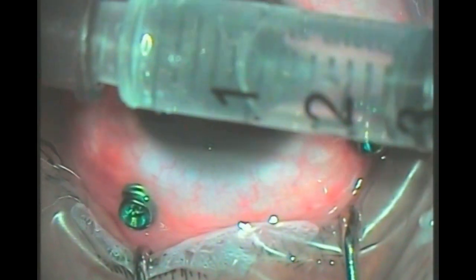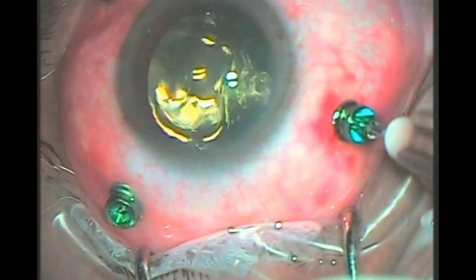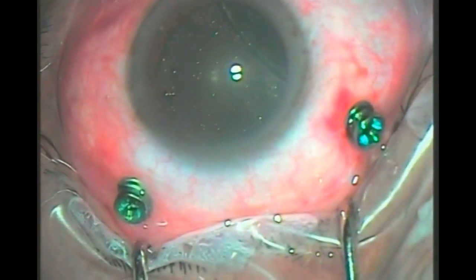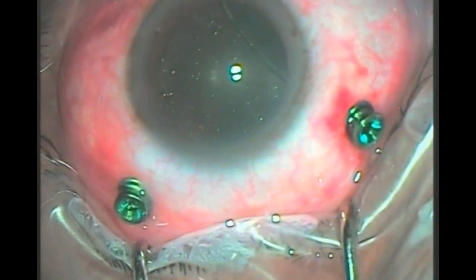By holding the syringe in the needle down position, give the syringe a gentle tap so that the air bubble moves towards the plunger and saline moves towards the needle end. Ask the assistant to turn off the infusion line.